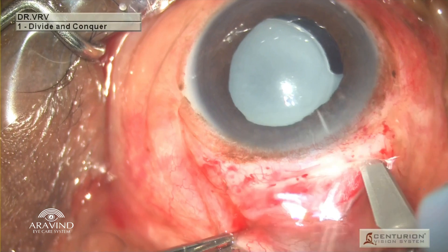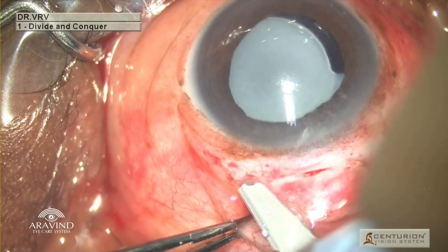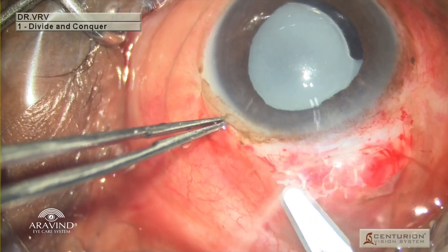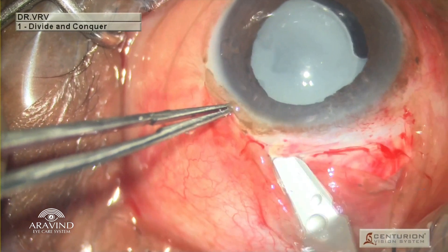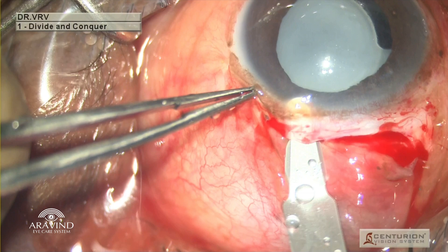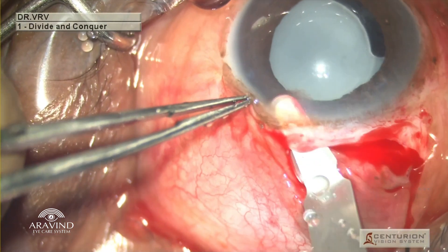Using a crescent blade, a straight incision is made, and with the same blade it is swiped from right to left a couple of times until a scleral plane is achieved. Once the plane reaches the limbus, with heel down, very carefully a new tunnel is created.